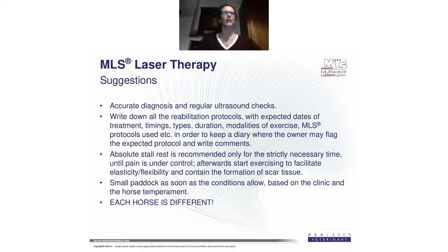Absolute stall rest is recommended only for the strictly necessary time in the very hyperacute phase, until pain is under control. Afterwards, start exercises to facilitate elasticity, flexibility, and contain the formation of scar tissue. In my experience, if it is possible to start the use of laser therapy in the very acute phase, the formation of scar tissue is very, very low. If we start laser therapy when there is already a chronic situation, we cannot help too much with the reduction of the scar tissue, so the structure will stay bigger in diameter.